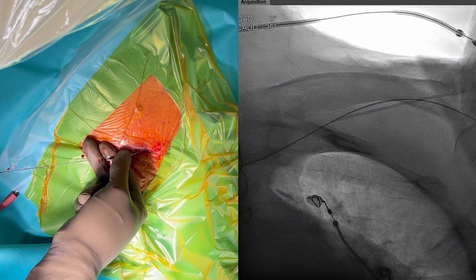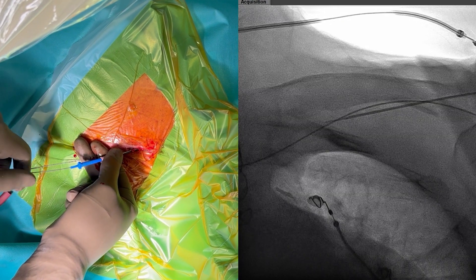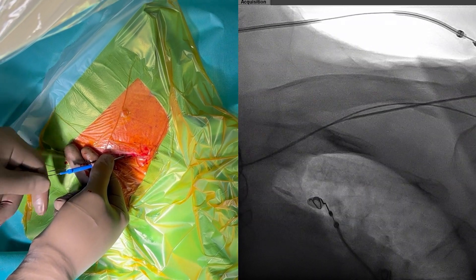When additional leads need to be placed we can use the existing guide wire to guide the second or third puncture. The guide wire should advance easily into the venous system.